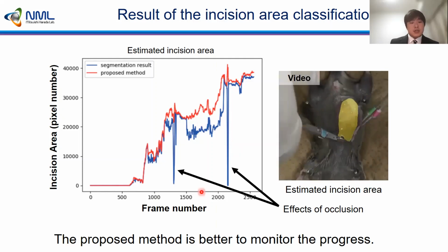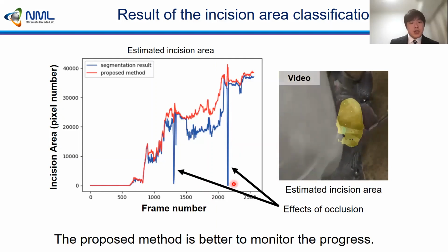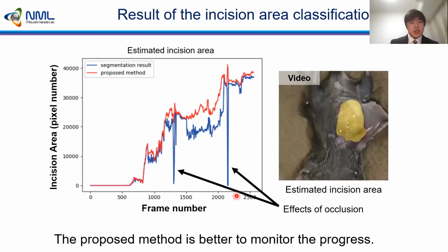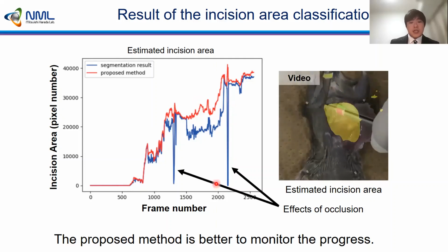The estimated incision area was greatly reduced when the incision area is occluded by operators' hands or surgical instruments. But our proposed method was able to reduce these effects. So the proposed method is better to monitor the progress of the incision task.